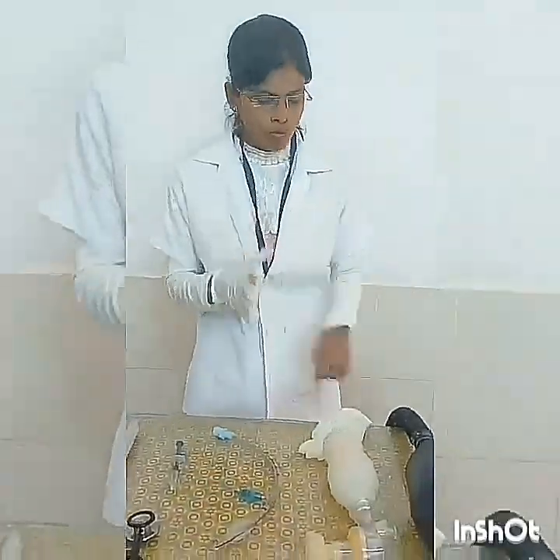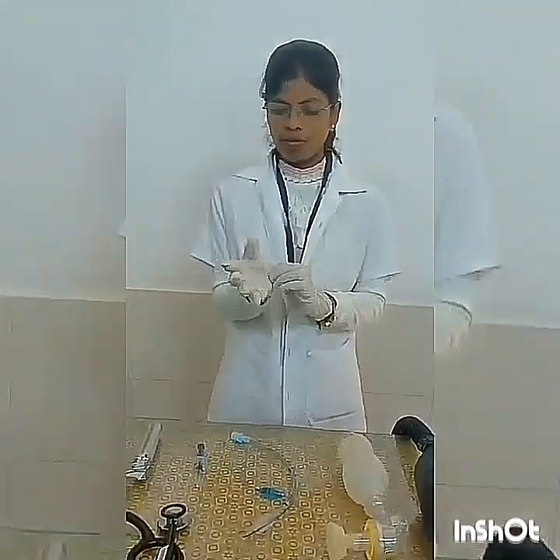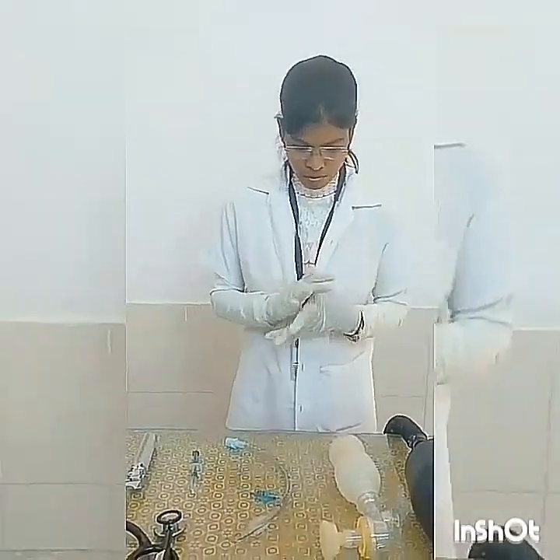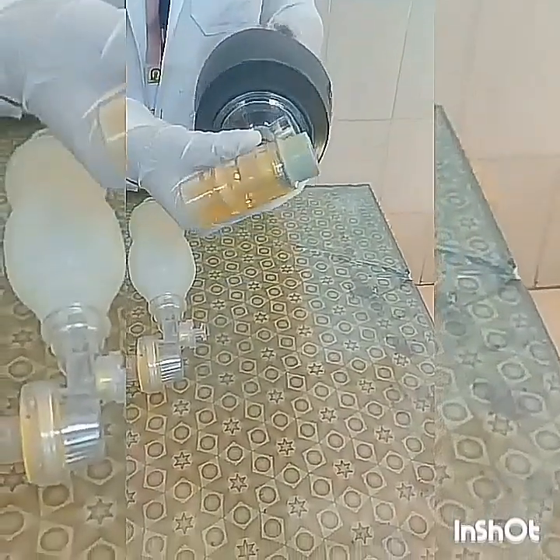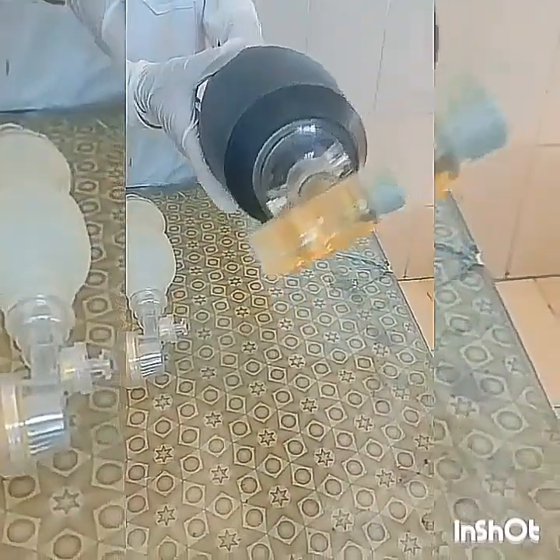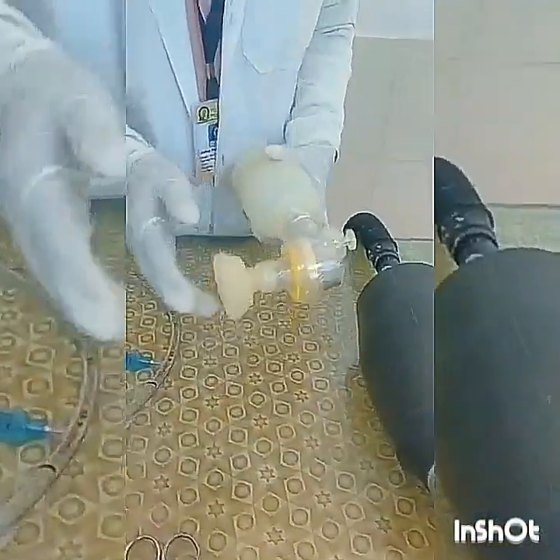Wear the mask and gloves properly. Here we discuss the equipment required for endotracheal tube intubation. First we see the most important, that is the AMBU bag, which means ambulatory manual breathing unit. This is the pediatric AMBU bag.